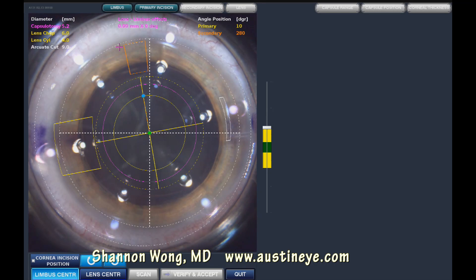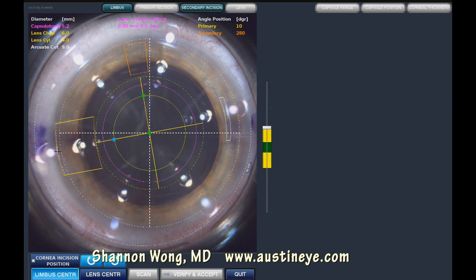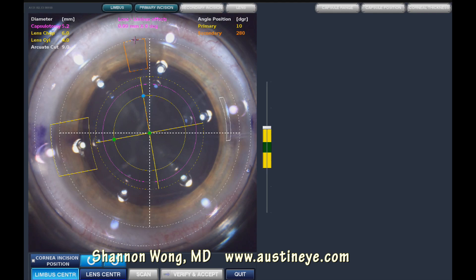In this screenshot, you're seeing us aligning the LensX incisions. We move the primary incision peripherally to the limbus. My primary incision width is 2.8 millimeters. My secondary incision has a 1.2 millimeter external opening and a 1.0 millimeter internal opening.